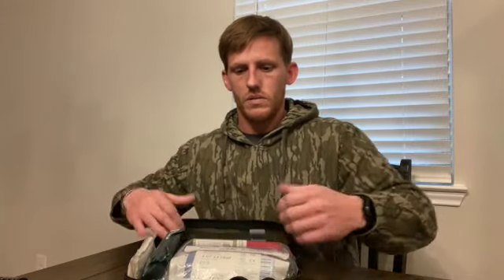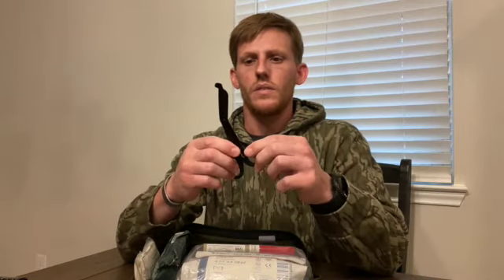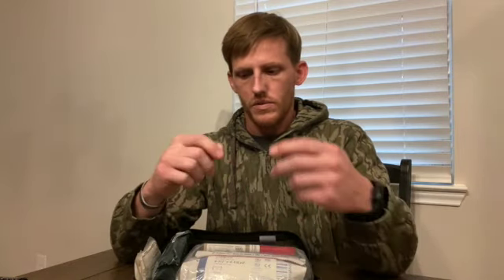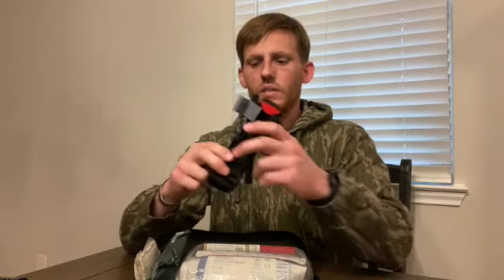I'll open it up so you guys can see the contents as I open it. The scissors fell out — this is how it will be stored as you open it. So first things first, I got a pair of trauma shears. These aren't full size — these are like four and a half or five inches. I like these because they're not full size but they do the same thing. They're made out of the same material and just as strong, but they don't take up as much room. Next, like we covered in the last video, I have a tourniquet.